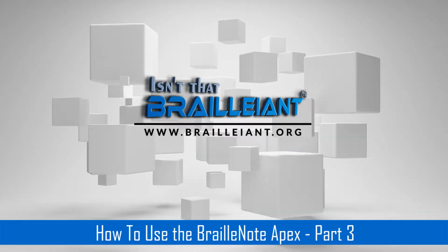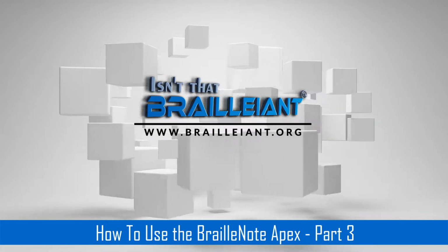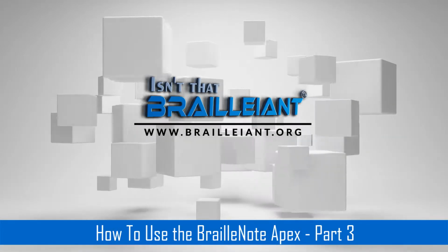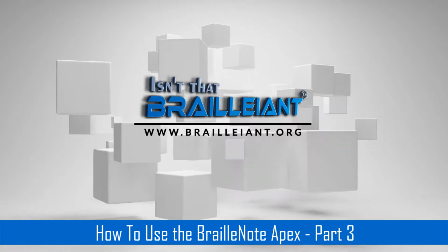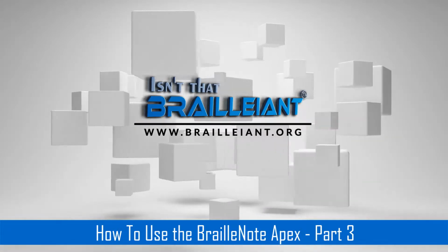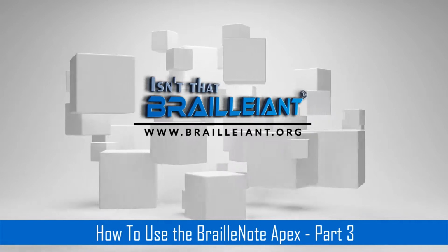Date. This date and time, when you get your Apex, is going to be set completely wrong. So in section 2 of part 3 of this tutorial, I am going to cover how to set your date and time, and you're going to do it through the utilities menu that I discussed in part 2.